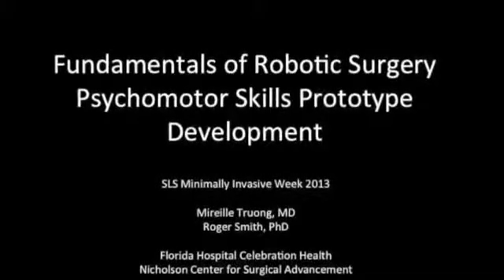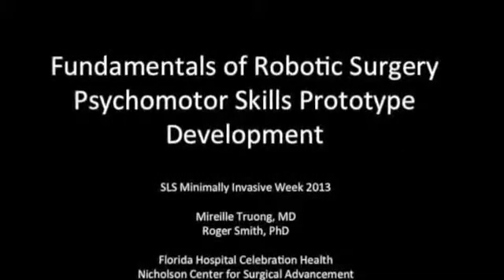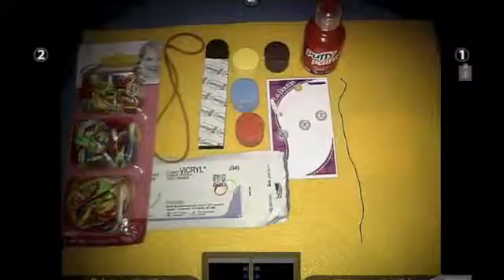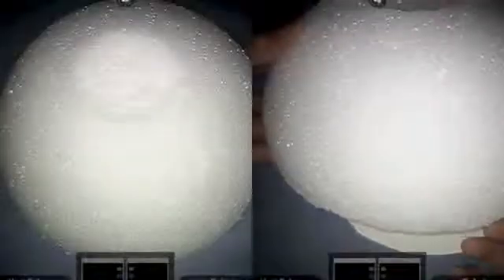With the rapid advancement of robotic surgery, there is a need to develop a robotic surgical education assessment and training tool similar to FLS for laparoscopic surgical training. The objective of this video is to develop and test an all-in-one psychomotor skills prototype for possible use in development of the fundamentals of robotic surgery curriculum.